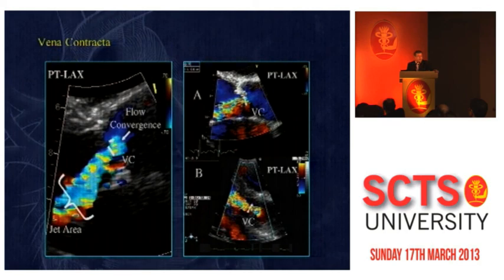So it's impossible to have a regurgitant volume of 80 mL in a ventricle that is not large, like 120 mL in diastole. If you have 80 mL of regurgitation over a normal left ventricle, which is 120, 140 mL, you should all the time have at least 200 to 220 mL of end-diastolic volume. It's impossible also to calculate 80 mL of regurgitant volume if your total stroke volume is also 80 mL. So if these numbers do not fit together, then you are in trouble.